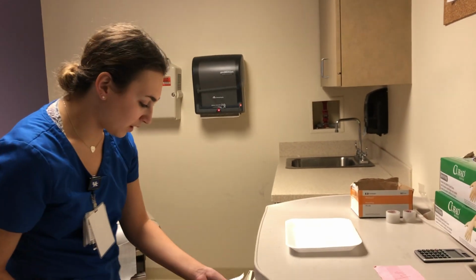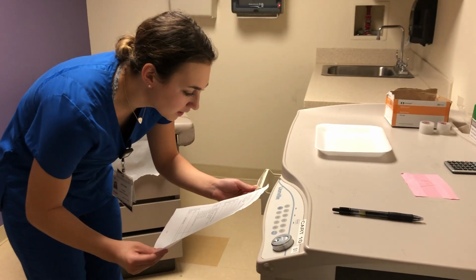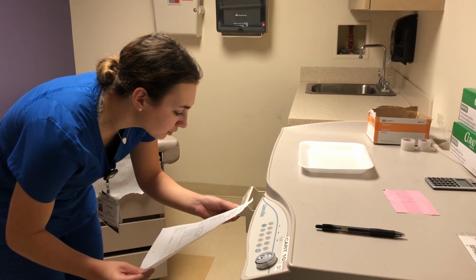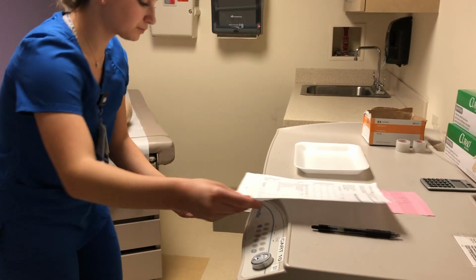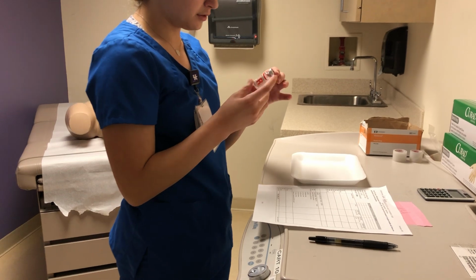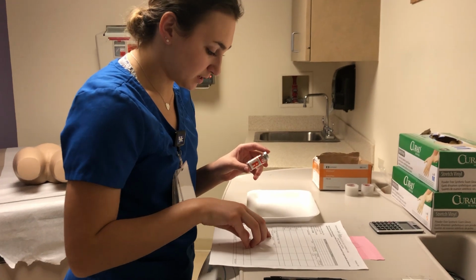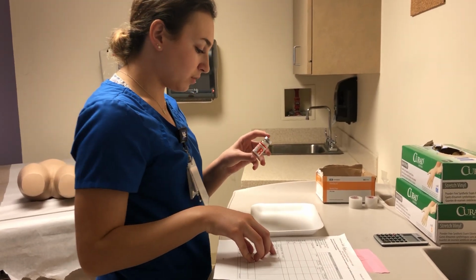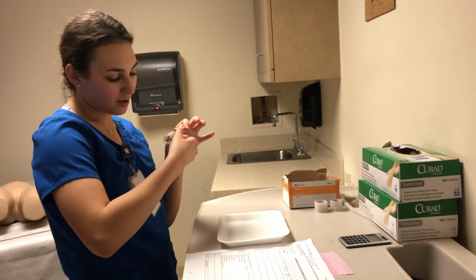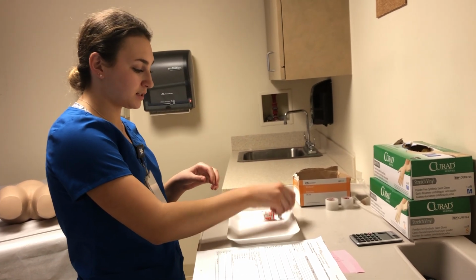So I'm going to verify. My patient's name is Ren Harumi. I am in his drawer, so the date of birth is 03/03/83. The ID is 160011180. So from his drawer, I'm going to be taking a vial of regular insulin. It is 100 units per milliliter, which is what the MAR says. Regular insulin, 100 units per 1 milliliter. The bottle is intact, it's not broken, and it's unopened. The expiration date is May of 2026, so it is not expired.